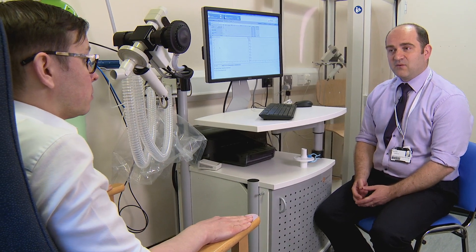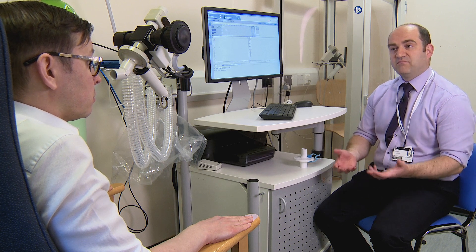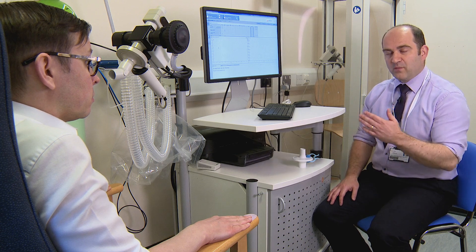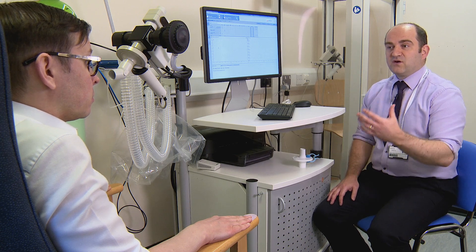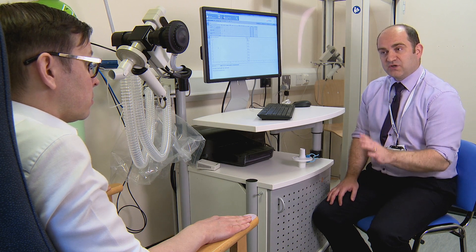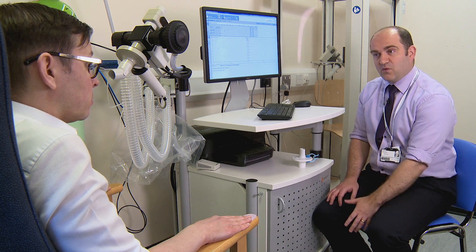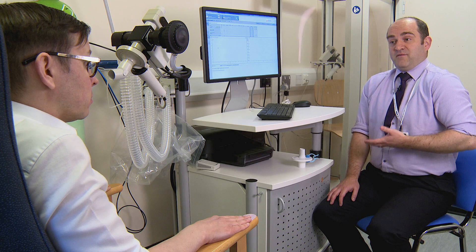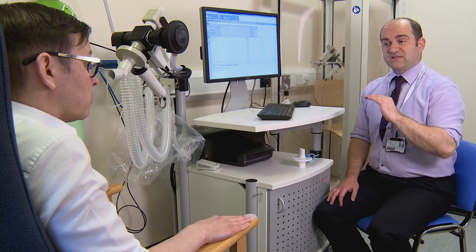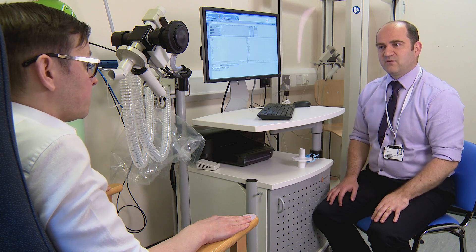This test is going to look at how easy it is for gases to get from your lungs, across into your bloodstream and back again. What I'm going to ask you to do is start breathing normally on the mouthpiece. Then I'll ask you to take a nice breath in, empty out as far as you can, really push, keep going for as long as you can. When you can't push anymore, I'm going to ask you to take a big, deep breath right up to the top. Fill your lungs. When you've got to the top, hold your breath there for about 10 seconds and then breathe back out through the machine. And then that will be the test over. Does that all sound okay?